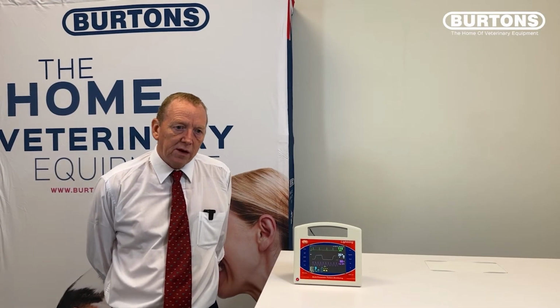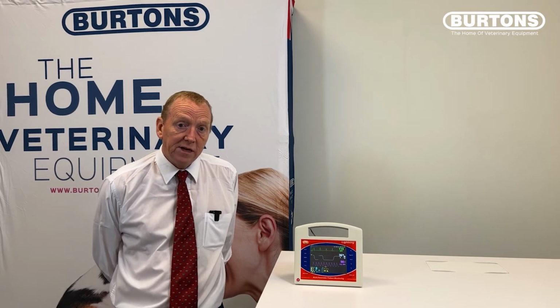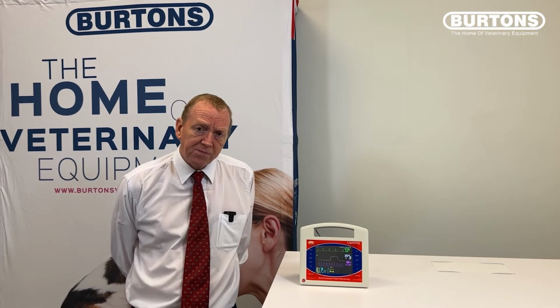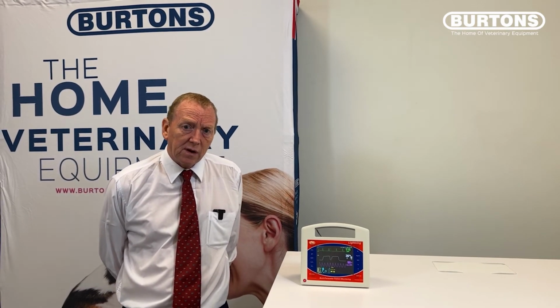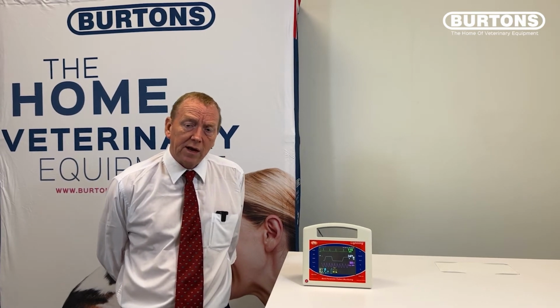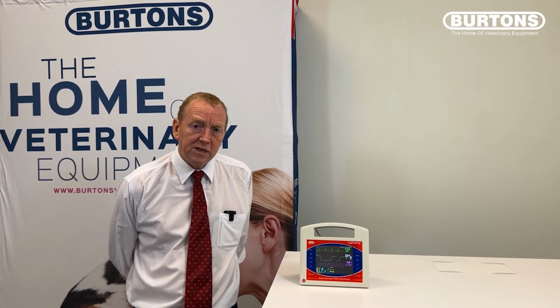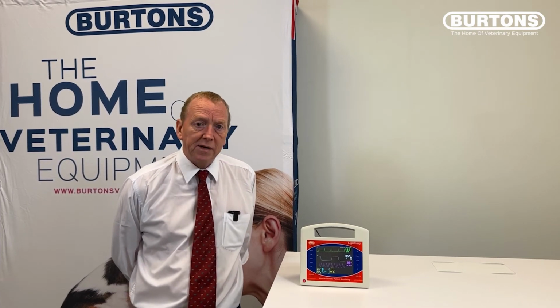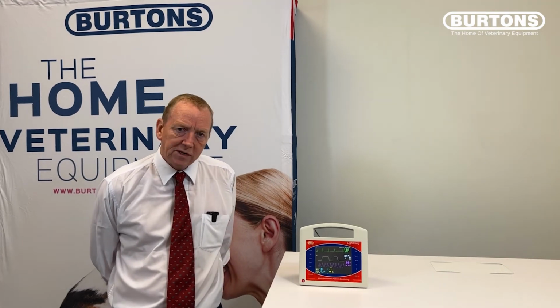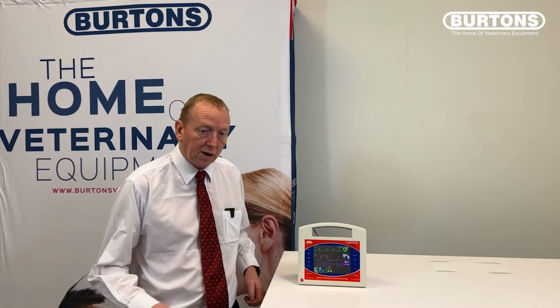One of the nice features of Lightning is the ability to use the monitor in its ECG module to record diagnostic quality ECG tracings. So this means that at a surgery or at a collapsed dog or wherever, even an animal in a kennel, you can record and store these ECGs from the unit here and then take it to the computer for later analysis. The procedure to do this is very simple, and I'm going to go through this with you now.